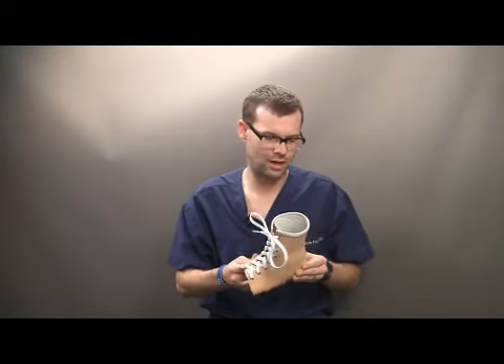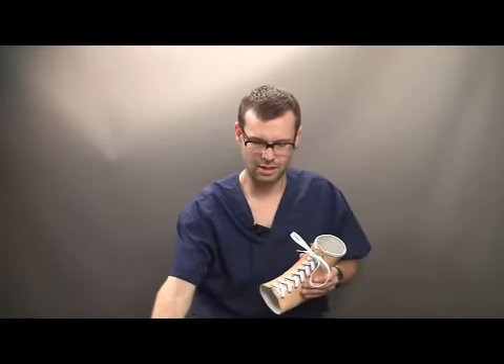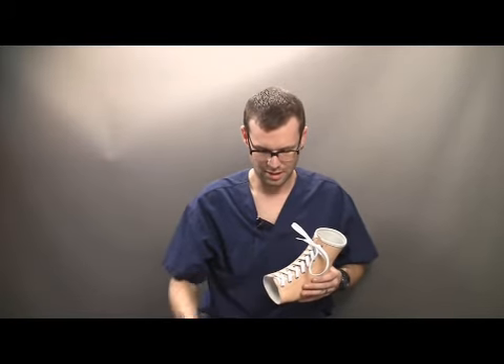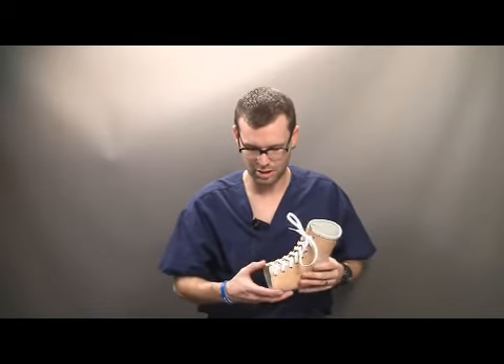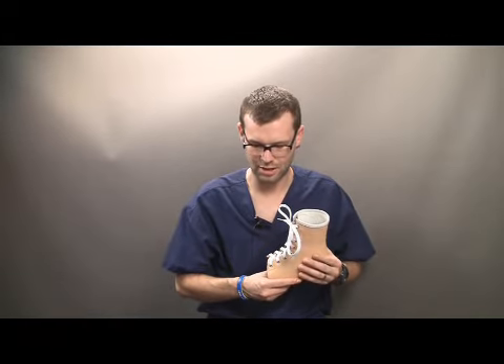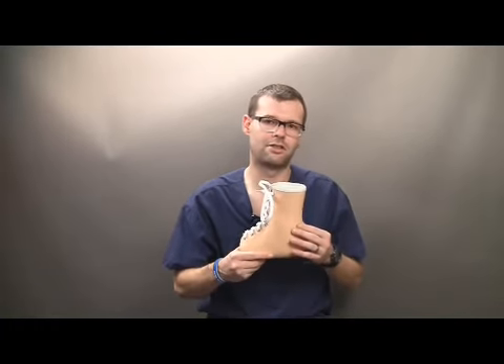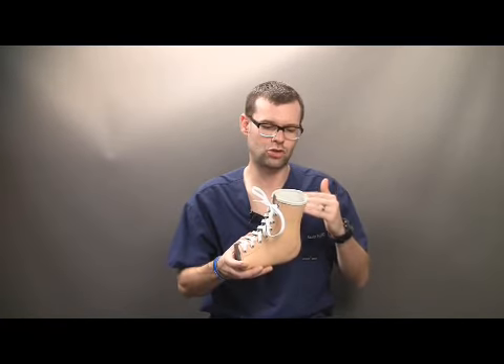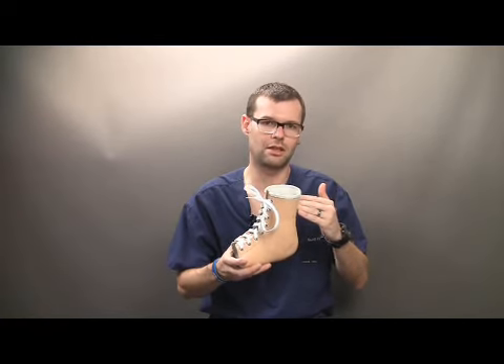As far as the scope of practice for pedorthics, the ABC and the certified pedorthist's scope of practice does say that, excluding footwear, the proximal height of a custom pedorthic device does not extend beyond the junction of the gastrocnemius and the Achilles tendon. And that's how this device has been fabricated. We are able to have a slightly shorter device to meet this scope of practice because of the custom pre-tibial shell. The circumferential control allows us to disperse those forces on the dorsal aspect of the foot instead of having to go higher up into the lower leg.